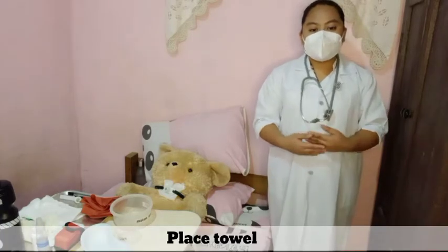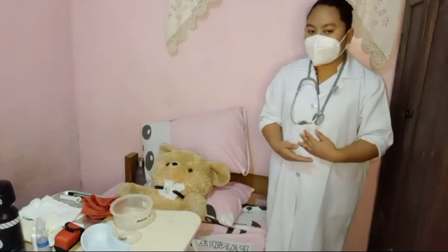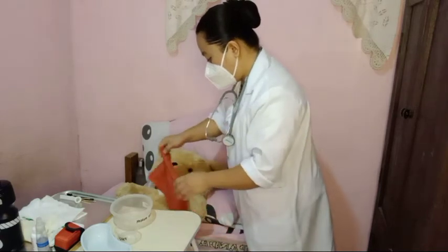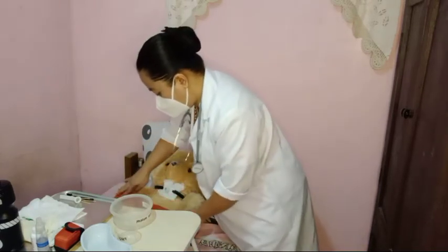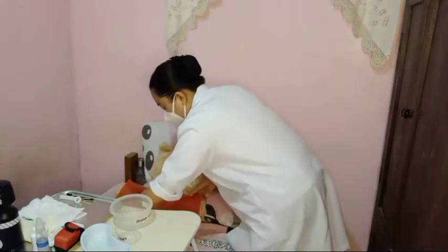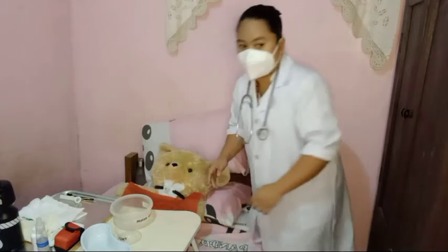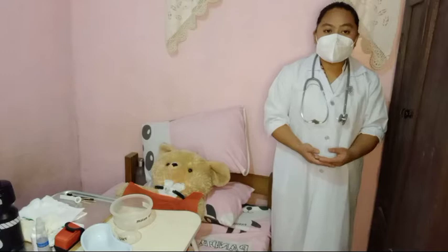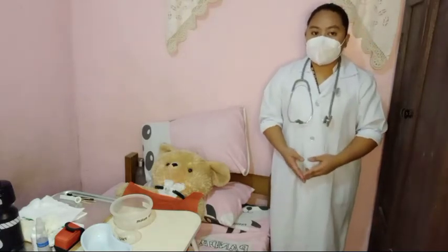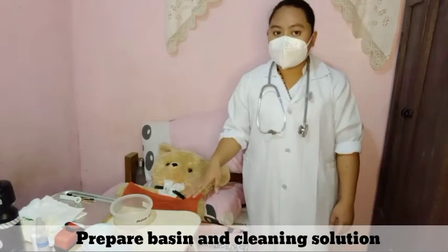Place the towel below the tracheostomy site, covering the neck and the chest of the client. Put on mask, face shield or goggles, and suction the tracheostomy if necessary. Prepare the basin and cleaning solutions.